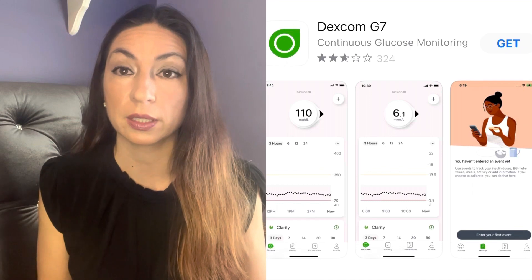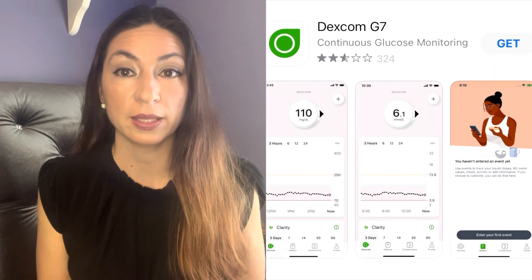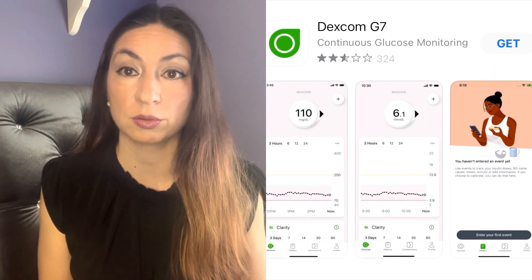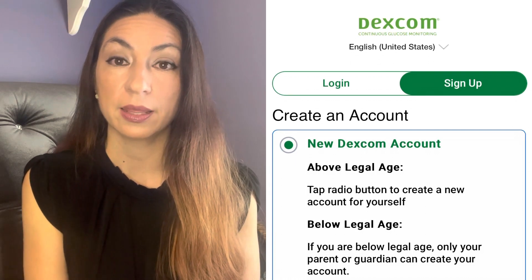Setting up the app is very easy. Make sure you have secure internet access throughout the setup. To get started, you can either scan the QR code in the instruction manual in your G7 box, or go directly to the app store and type in Dexcom G7. Download the app, open it, log in or create an account, then follow the instructions to set up your app and pair your device. The sensor warm-up timer tells you when you'll start getting readings and alerts.